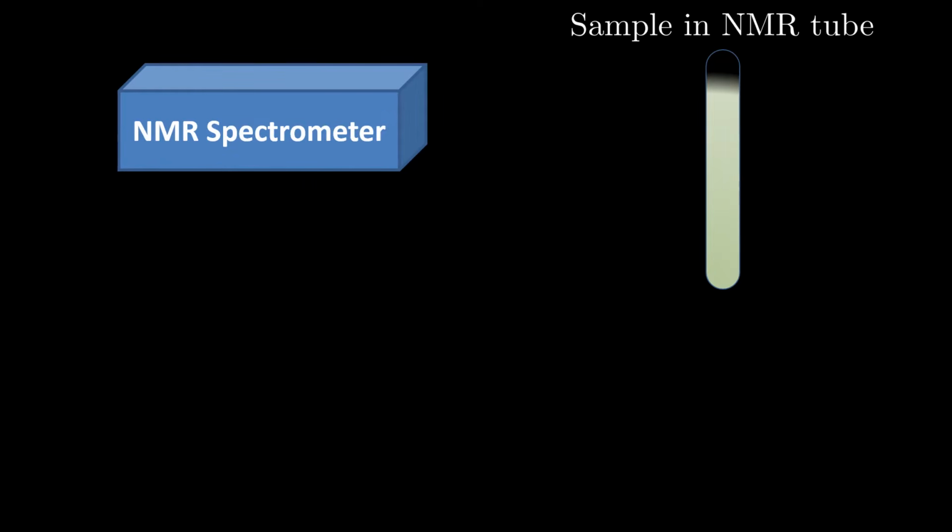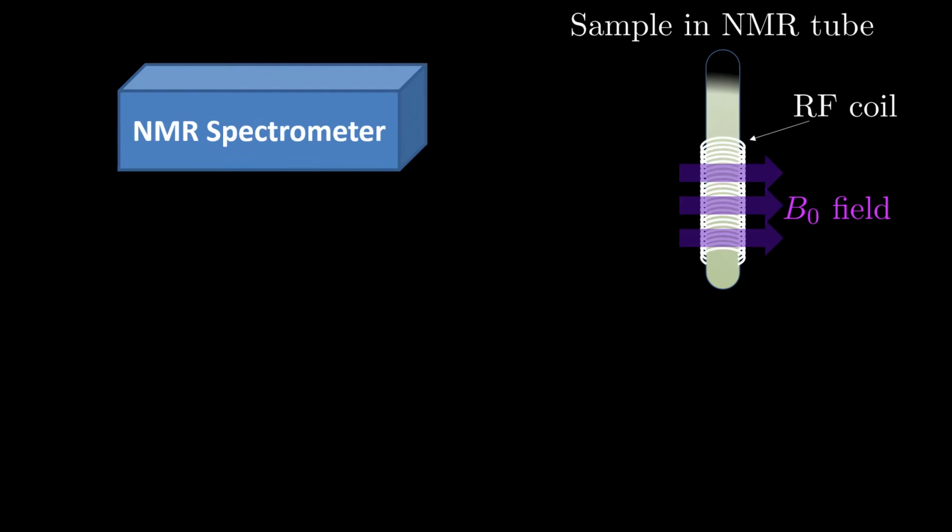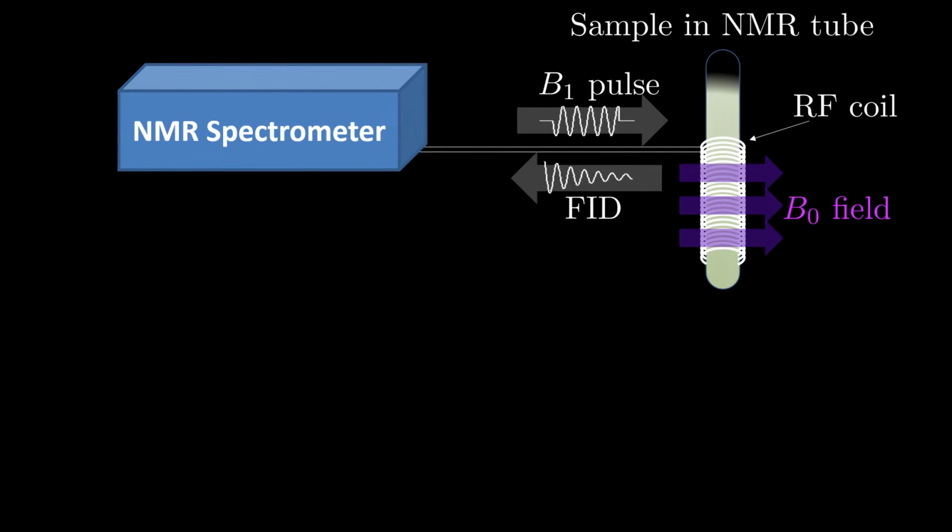So in order to perform this NMR experiment IRL, you need to go to the NMR physics store and buy yourself an NMR, a device which can deliver these excitation pulses and display the acquired signal on your oscilloscope. So you prepare a sample of plain water, plenty of protons, i.e. hydrogen nuclei, to examine. You place your sample in a strong magnetic field B0 and wrap the sample with wire, which will be an RF coil for transmission of excitation pulses and subsequent reception of NMR signals.